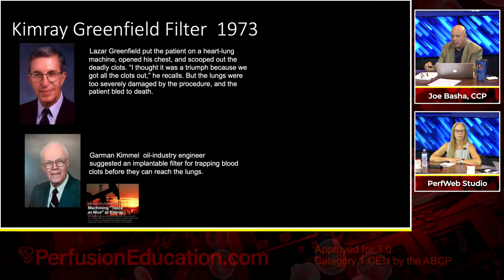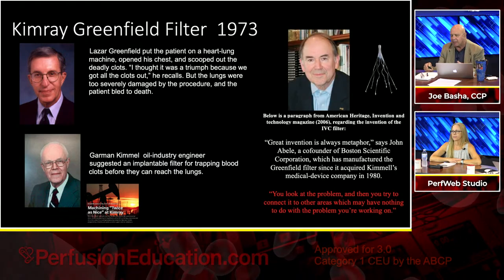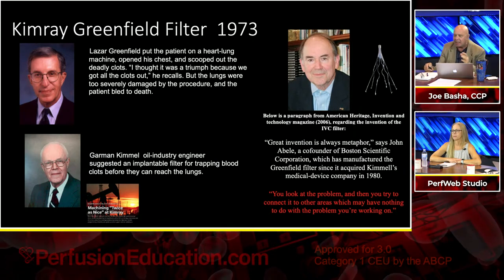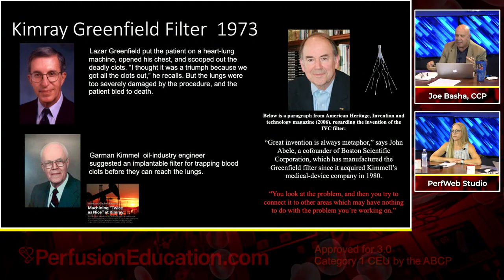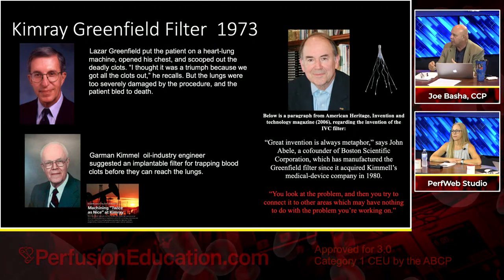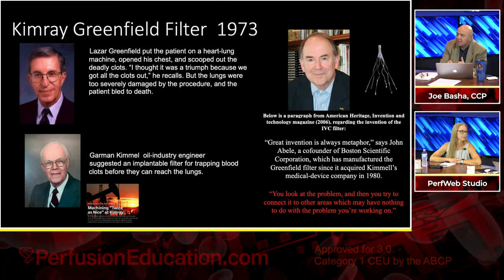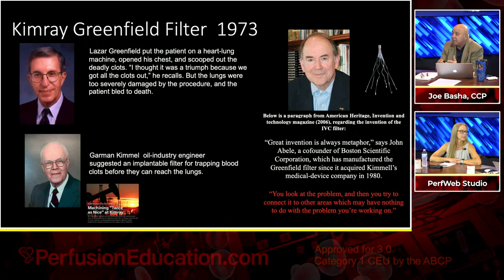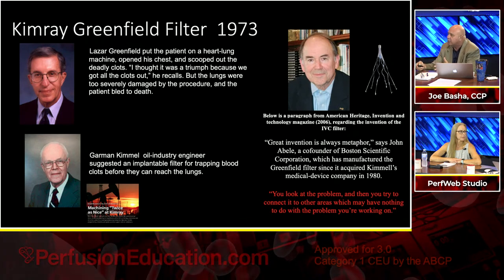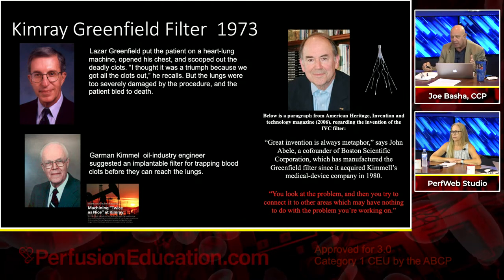Well, then comes along this guy. This is John Abele. He is the co-founder of Boston Scientific. And he is the person that they then went to, to help bring this product not just through the conceptual and developmental phase, but then also the production and distribution phase. And he said something that was very important, and it's down at the bottom in red.